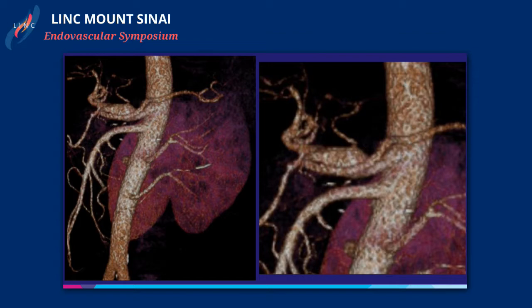You can take the splenic proximal pretty much. If I'm going to say only one and just do a fairly straightforward case, I would embolize the splenic, and then just put a long covered stent from the origin into the hepatic itself. Would you mess with the left gastric? Beg your pardon? Would you mess with the left gastric? It's too small. Yeah, it's pretty small.